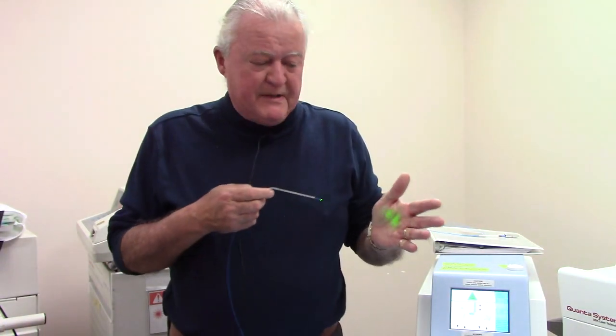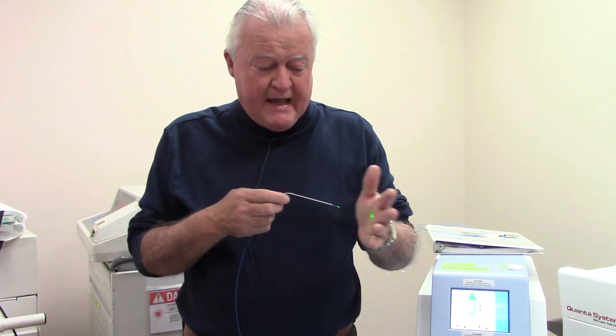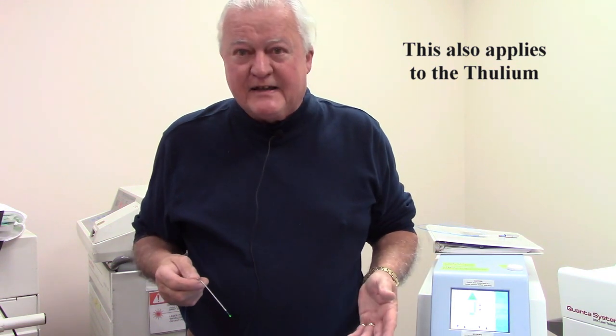Now for a final demonstration on the relative safety of distance from a Holmium YAG laser. Remember, the wavelength does not get into your eye, but it could burn the surface of your eye if you were close enough. But you've got to be pretty close to do that — that's not laser safety, that's stupidity. Don't pick up the fiber, hold it an inch away from your eyeball, and step on the pedal. That would be a problem.